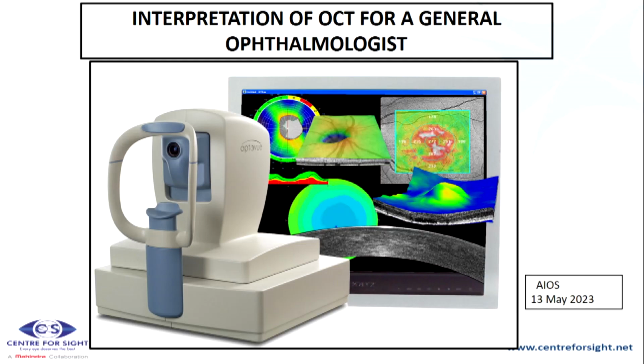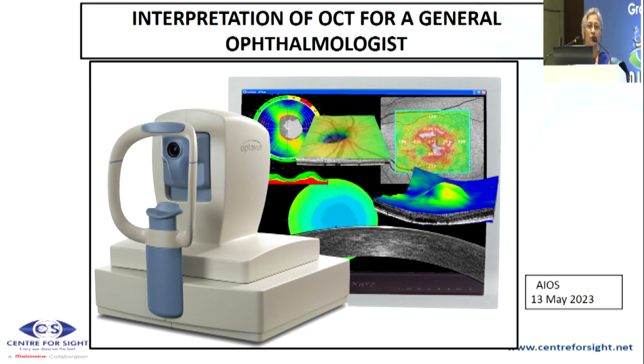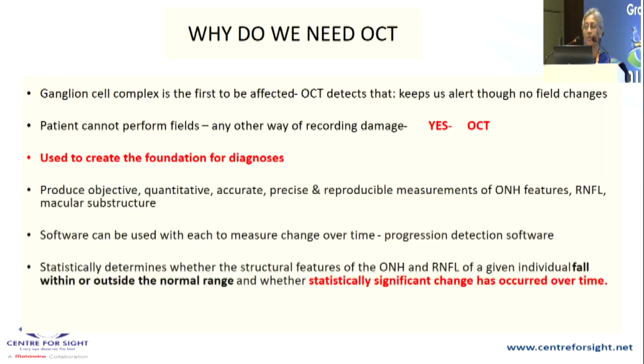Good morning, and welcome to the people who have come to hear us. And I'm going to present OCT the way I understand it and the way I put it to clinical practice. So this is, as he said, basically for a comprehensive ophthalmologist. The first question that arises in our mind is, why do we need an OCT? Why should I do an OCT for glaucoma diagnosis?